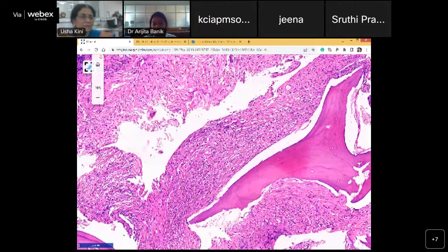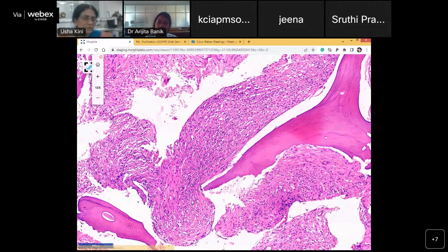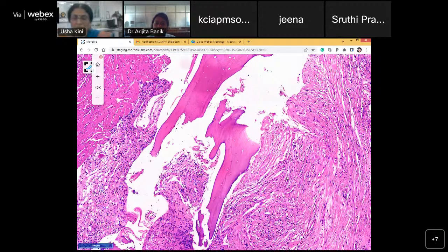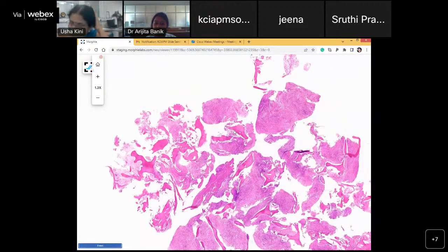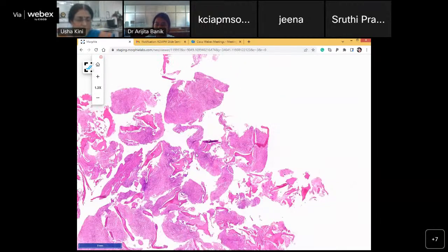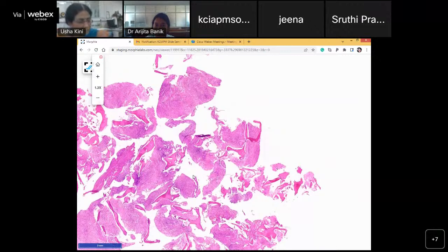But there is some synovial tissue, if I remember. I don't know where exactly it is. And there is an amount of synovium which is showing ulceration. So this patient went for arthroscopy. They hit the lesion on the periosteum and took out these chips of bone. So your diagnosis is xanthogranulomatous osteomyelitis, right? Yes.